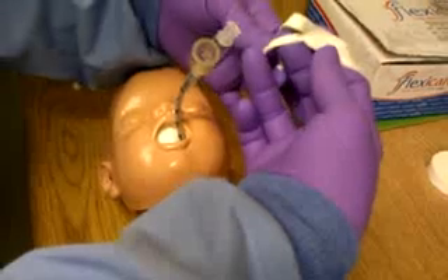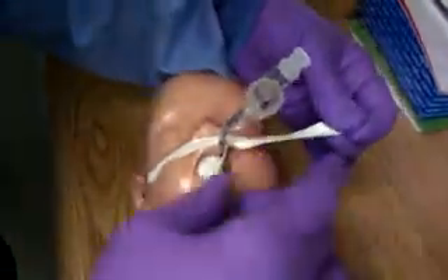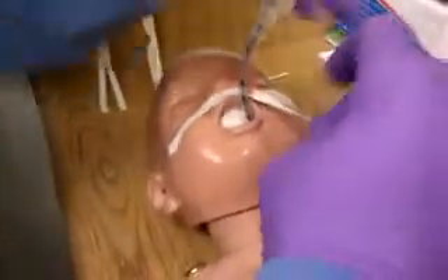You're going to take your first piece of tape. Make sure you have someone secure the tube, holding the tube in place. The tube needs to be very close, right up against that split in the tape. Then you want to take the bottom part and go nice and snugly around.